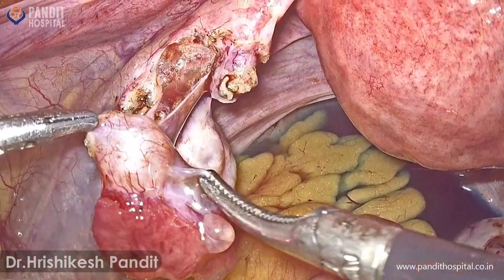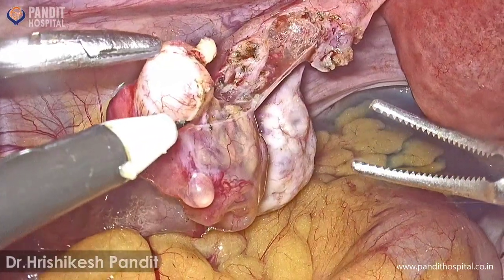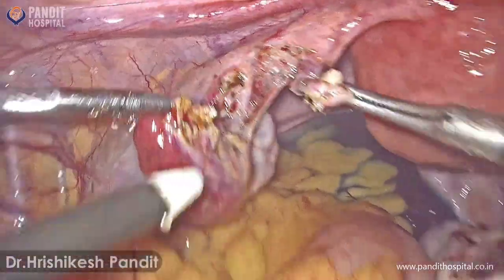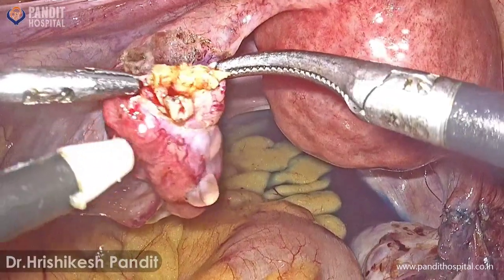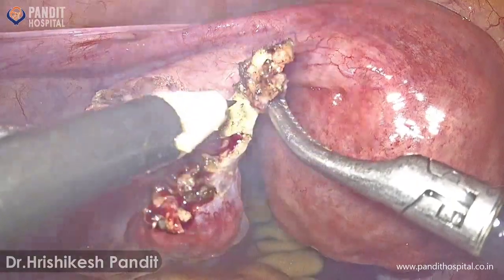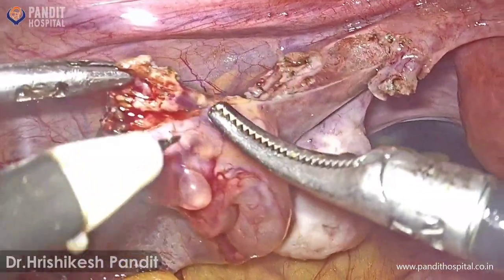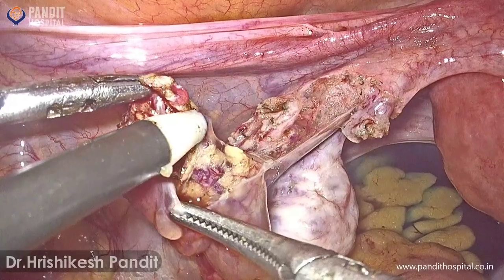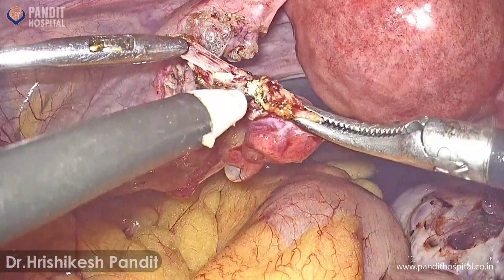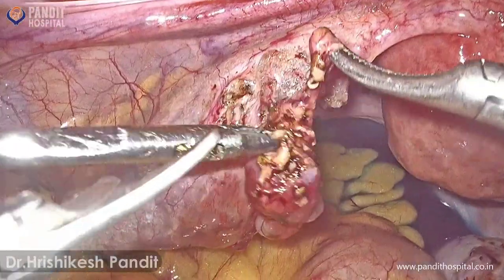Until and unless your anatomy is clear, do not take the stitches. If the tube gets everted, the entire procedure will fail. I am taking out the cyst wall. There is still a lot of fibrous tissue which I am removing using monopolar current, reducing the current setting so that lateral spread and tissue damage is minimized.